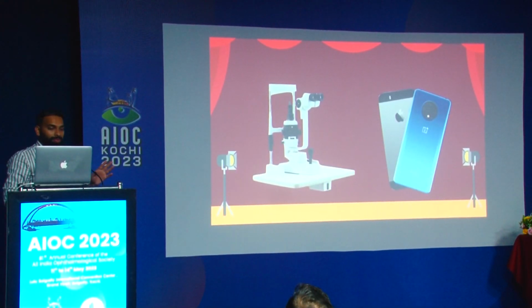But it is very much limited to the slit lamp, because without the slit lamp, gonio imaging is not possible. And recently there is only one article which showed the use of a smartphone for gonio imaging.